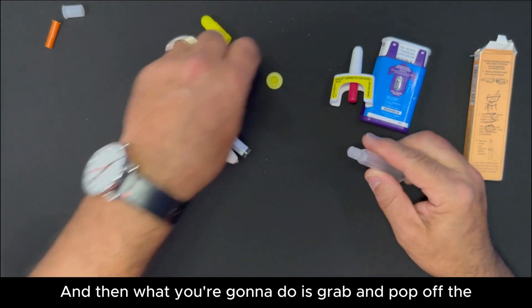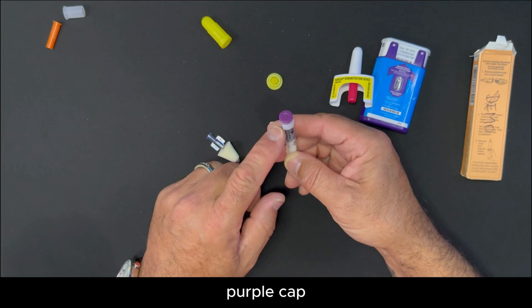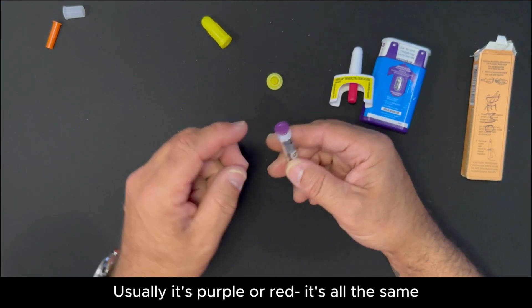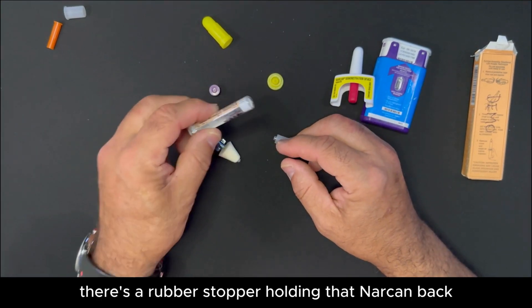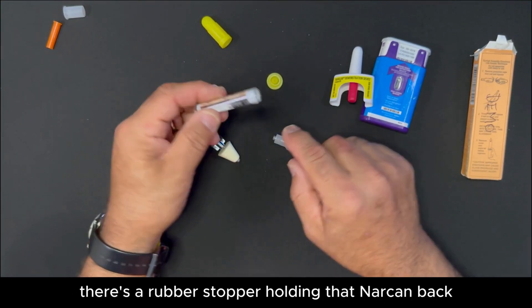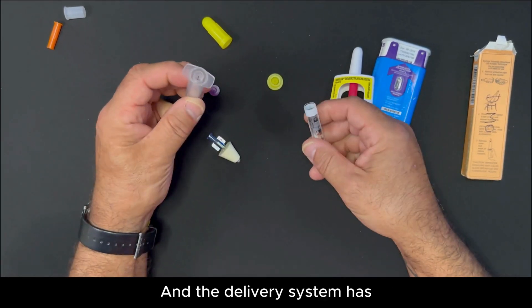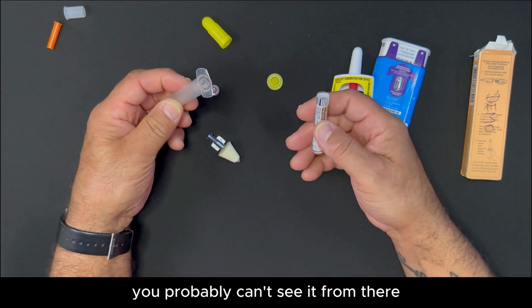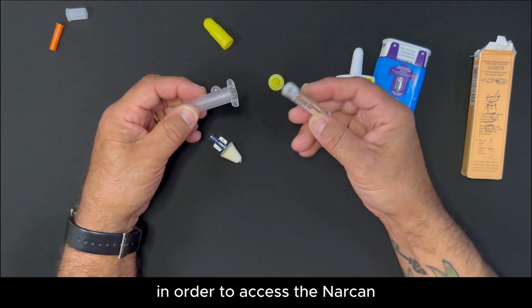Then grab and pop off the purple cap — usually it's purple or red, it's all the same. If you can see, there's a rubber stopper holding that Narcan back. The delivery system has a small needle there. The needle has to puncture the rubber in order to access the Narcan.